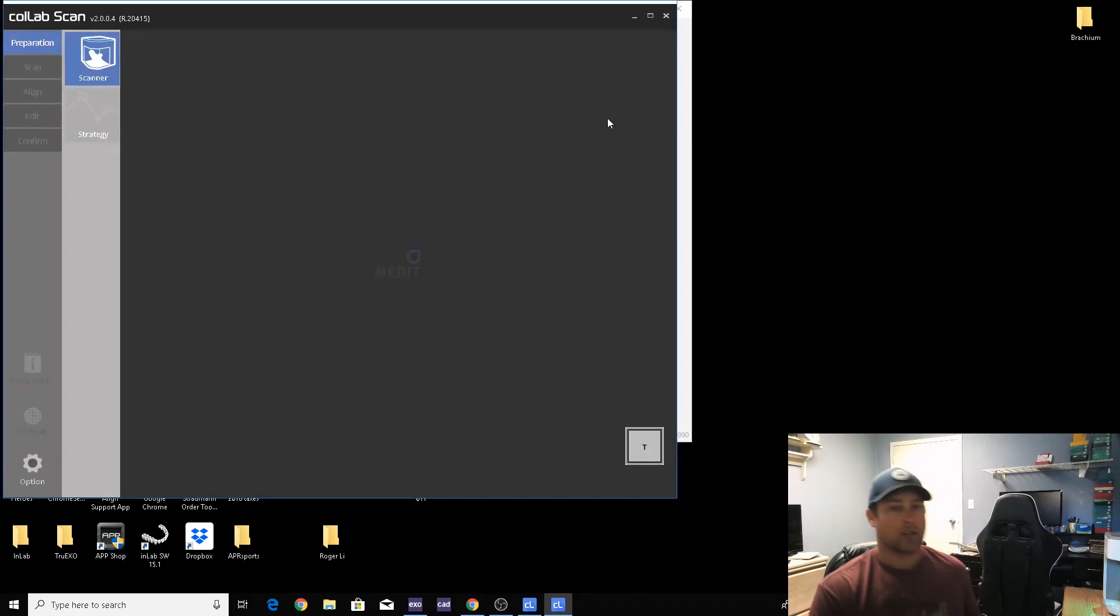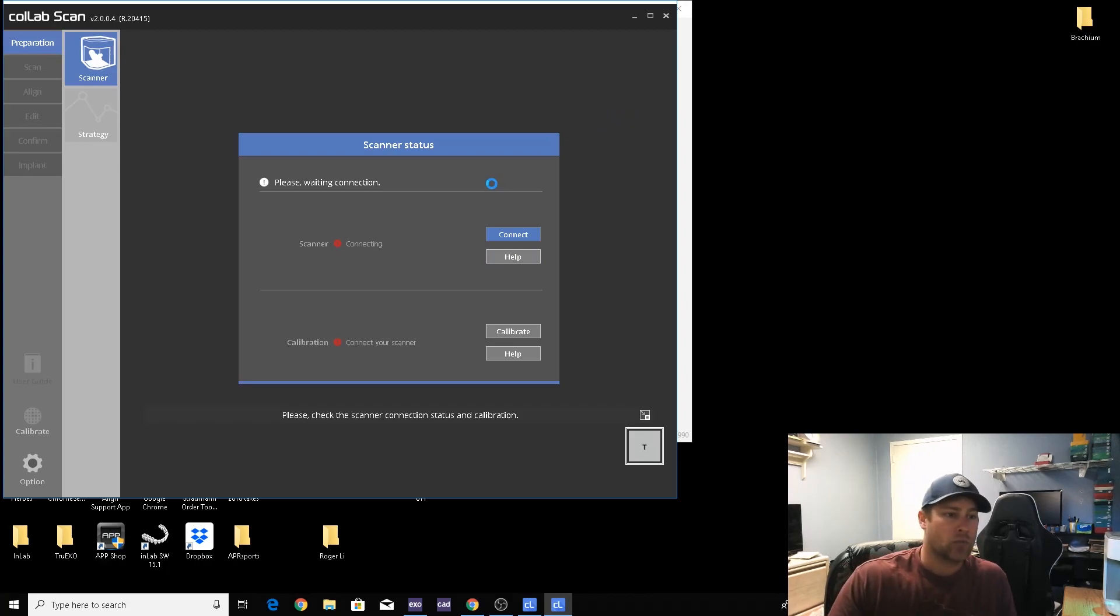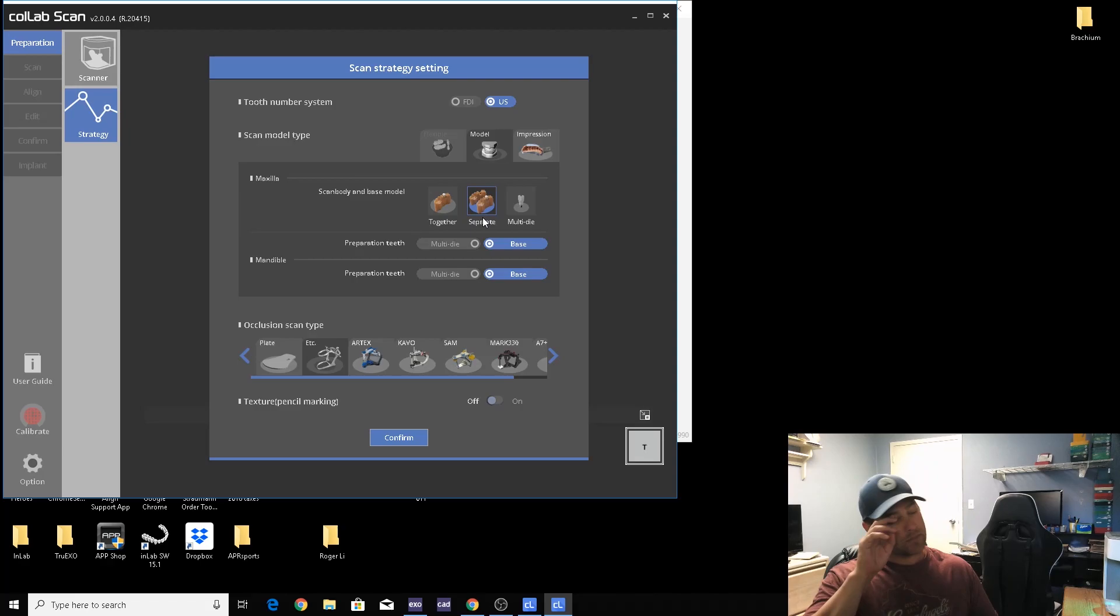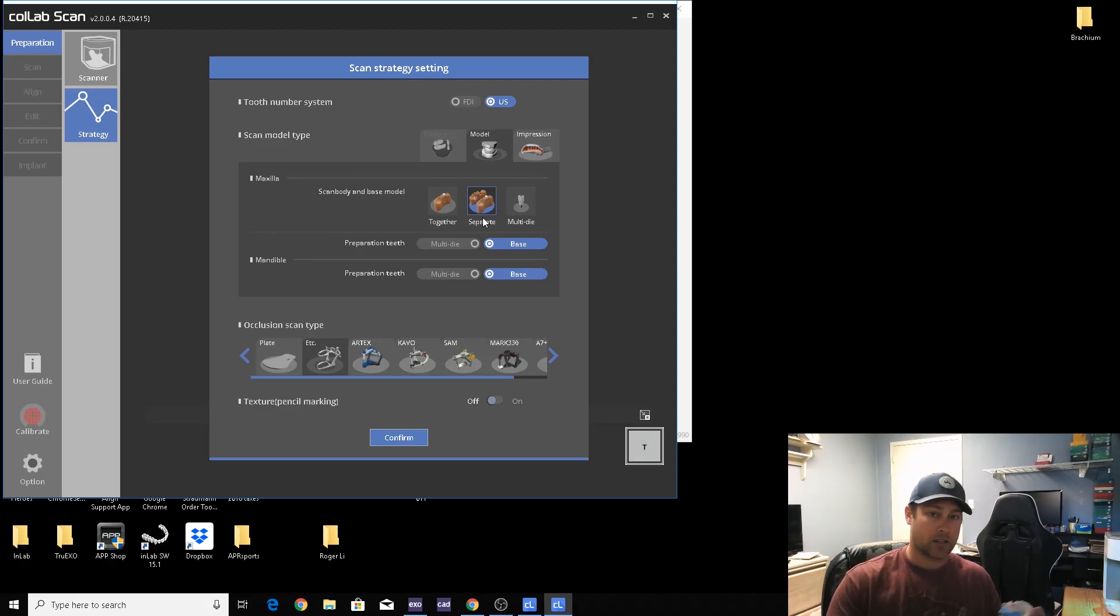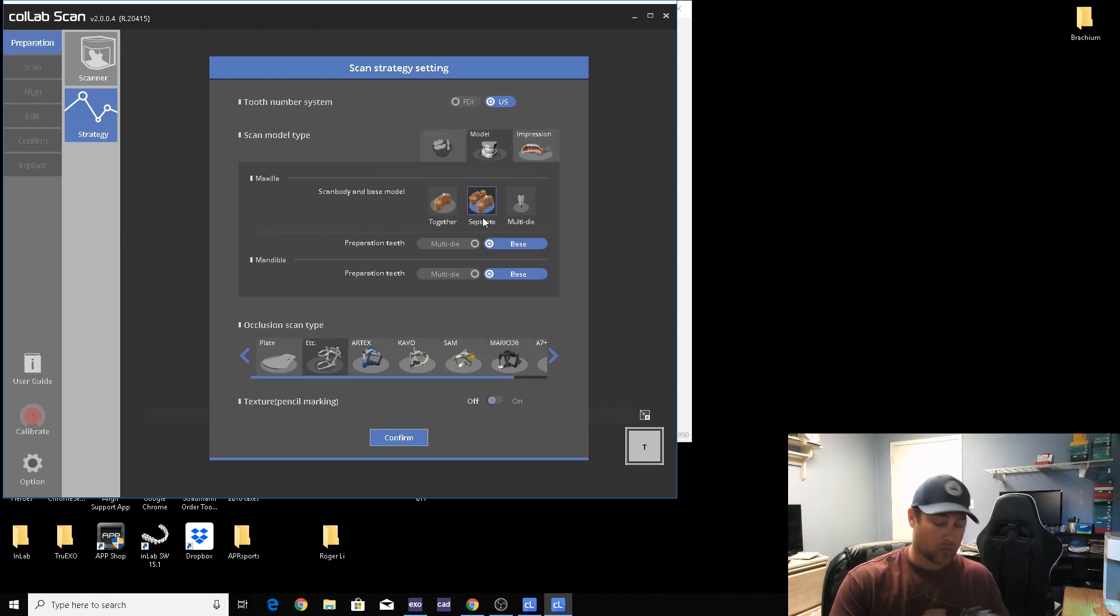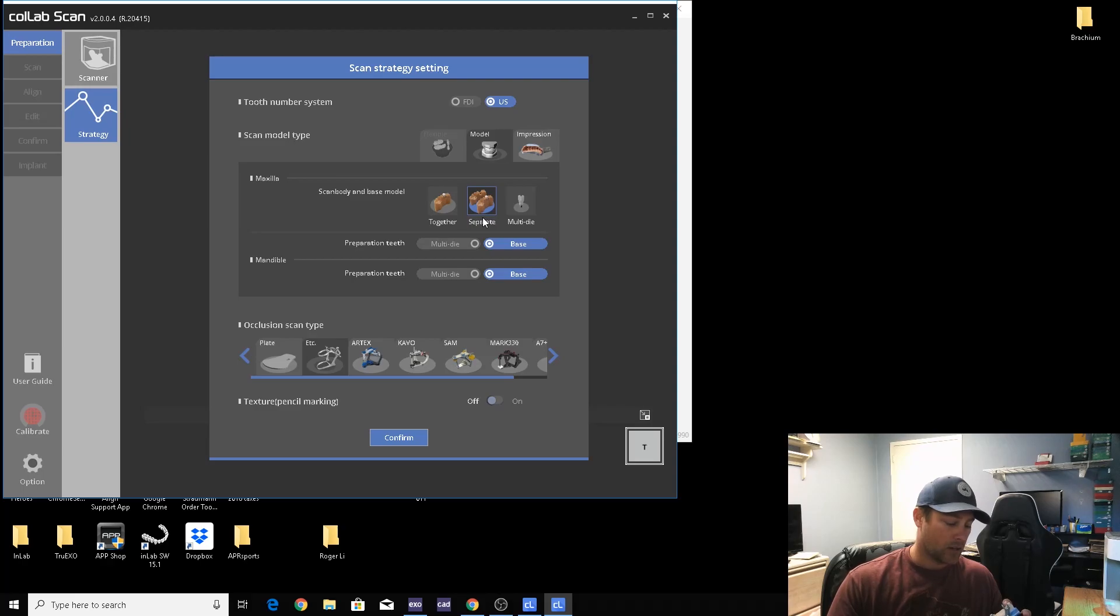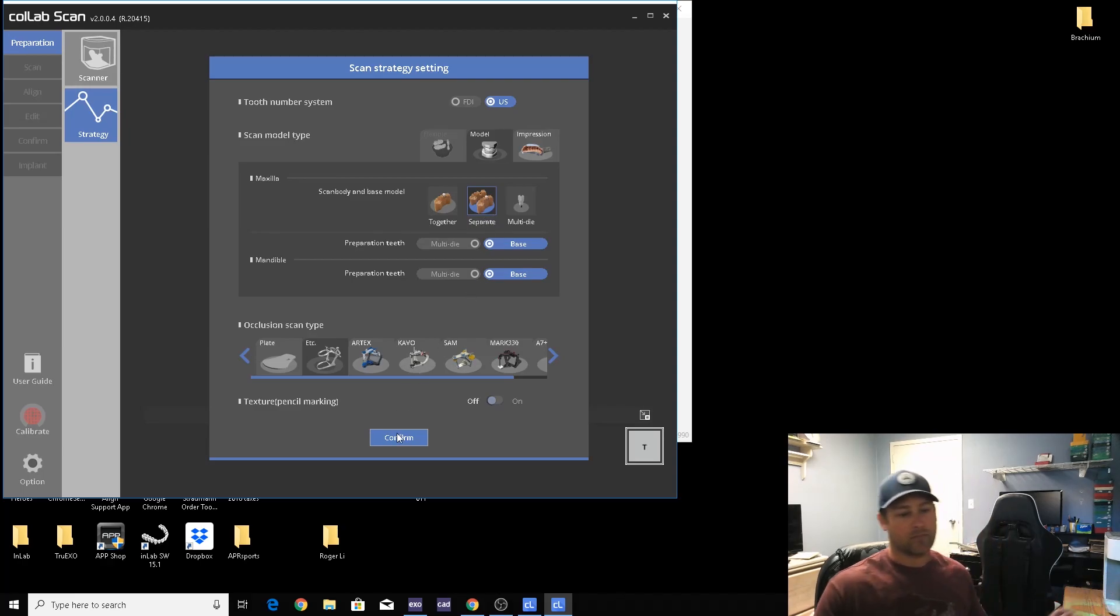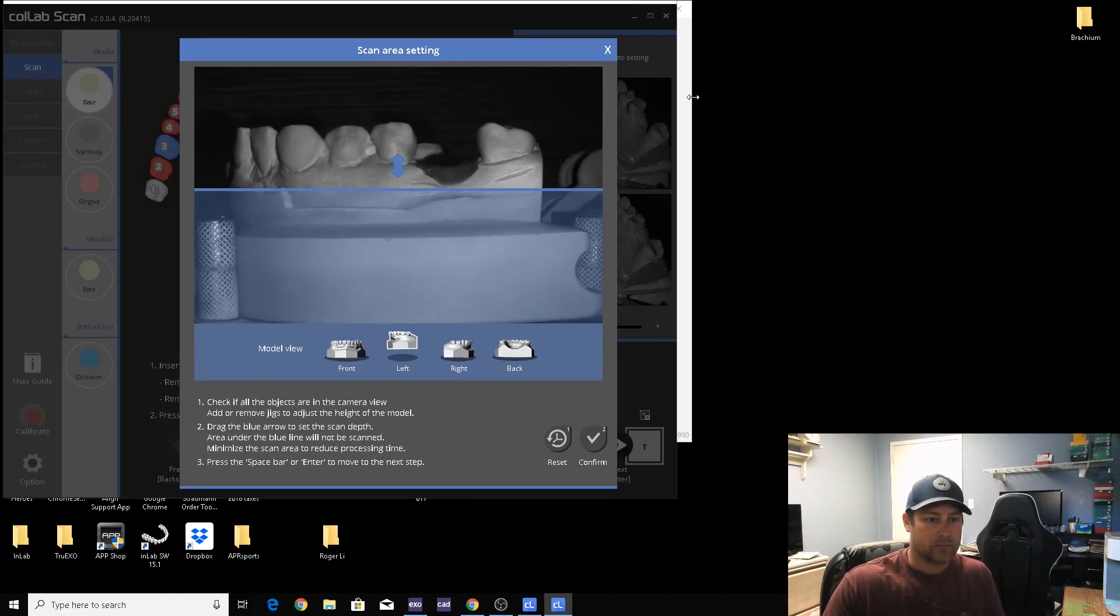One thing on the Medit software that you want to change is you want to switch this over to scan the scan body separate. If you scan them together, then chances are you're not gonna be able to scan the contact area of the adjacent teeth. It'll work if you're just doing a custom abutment because contact areas don't matter, but screw-retain, switch this over to separate and you'll be fine.